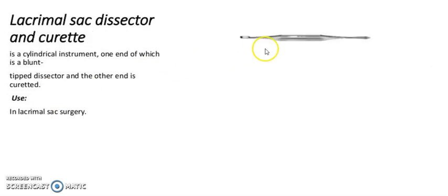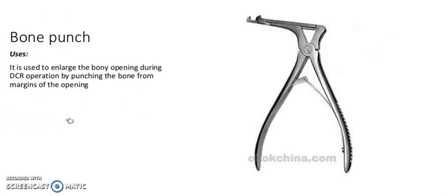It is a lacrimal sac dissector and curette. It is a cylindrical instrument; one end is blunt and the other end is tipped — one end is a dissector and the other end is a curette. Used in lacrimal sac surgery. It is a bone punch, used to enlarge the bone opening during DCR operation while punching the bone from the margin of the opening.